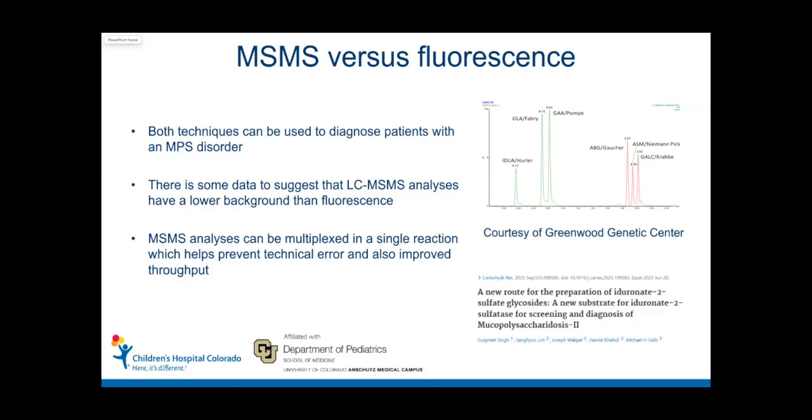And one of the really cool things about mass spectrometry is we can do a bunch of reactions in one single analytical reaction. We can measure a bunch of enzymes in one single reaction. This is a revolutionary concept, a really cool technology that has really changed how we think about doing diagnostic testing for MPS and all lysosomal diseases.